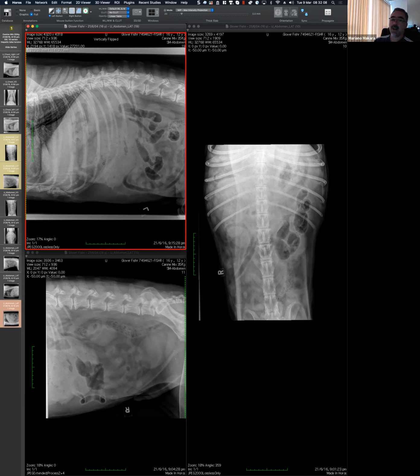If you have DR, like we have in NBS, there is the option that you can remove the plate. That option is usually loved because the plate is so expensive that when you buy it, the vendor is going to ask you, do you want me to leave it in such a way that you can take it out and play around with it?